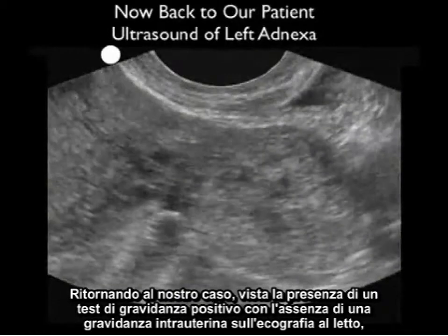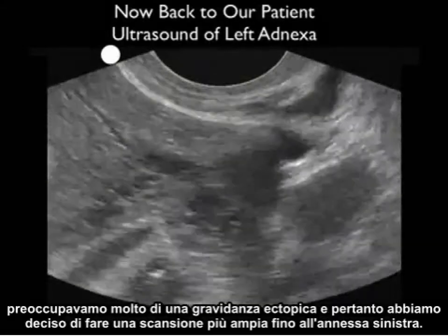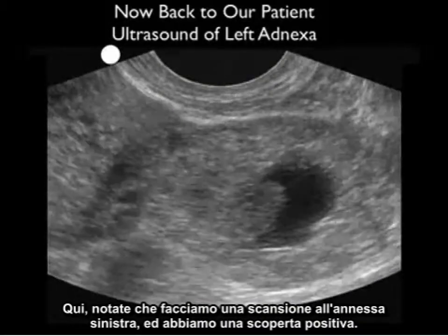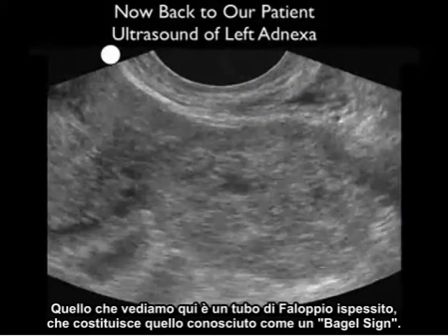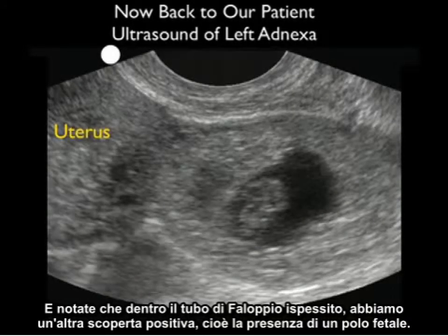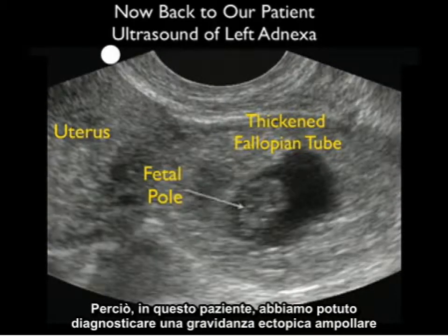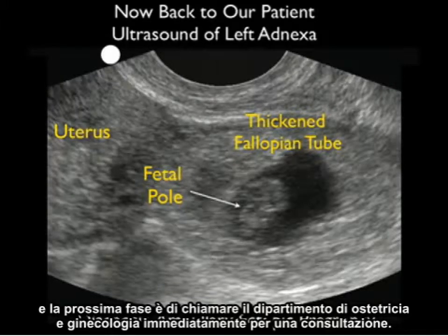Returning to our case, given the presence of a positive pregnancy test and the absence of an IUP on bedside ultrasound, we were very concerned about ectopic pregnancy and decided to scan out to the left adnexa. Here, scanning out to the left adnexa, we have a positive finding. What we see is a thickened fallopian tube comprising what is known as the bagel sign. And notice within the thickened fallopian tube, we have another positive finding — the presence of a fetal pole. In this patient, we were able to diagnose an ampullary ectopic pregnancy, and our next move was to call OBGYN STAT for a consultation.